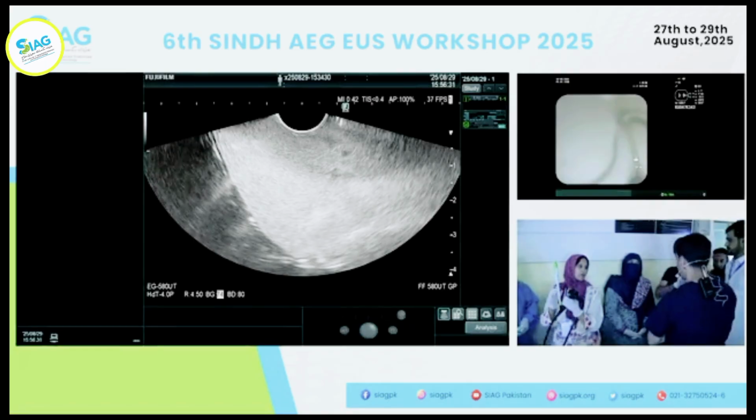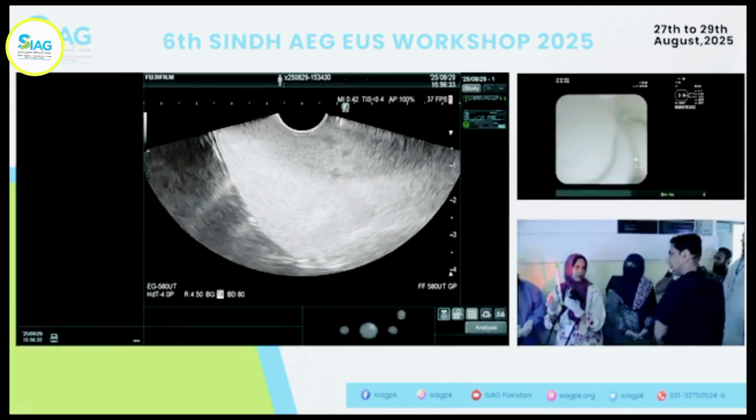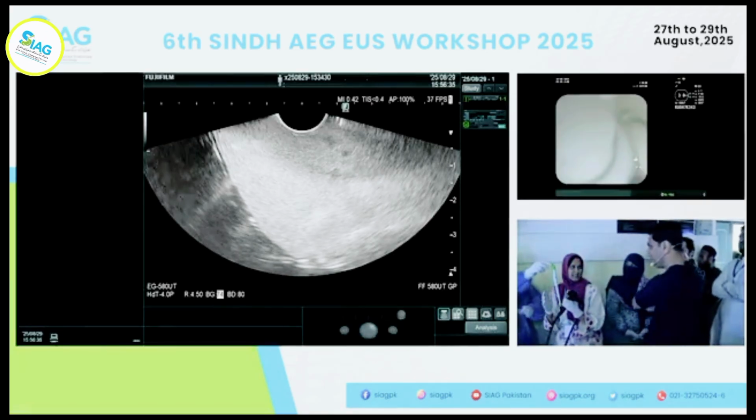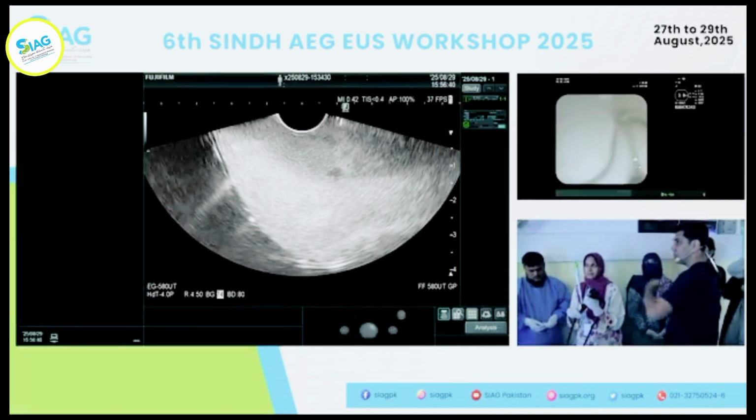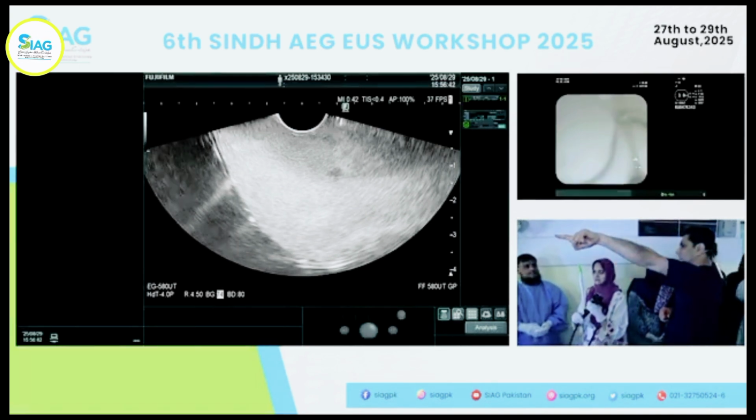Intermittent suction. What is the ideal size of the FNB needles? Because I read somewhere that for liver... For liver, well, the biggest we have is 19. So now we can see nicely the sheath, tip of the sheath out.